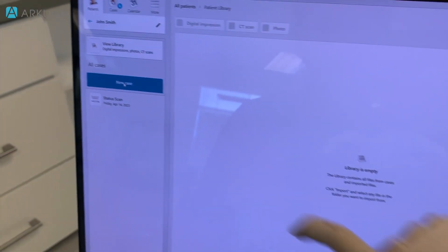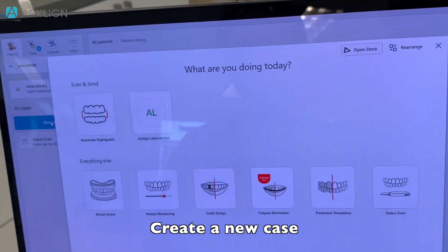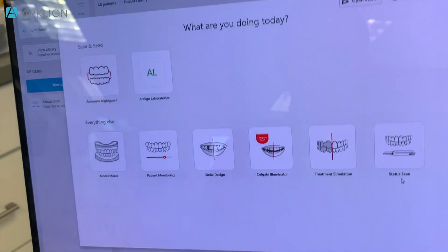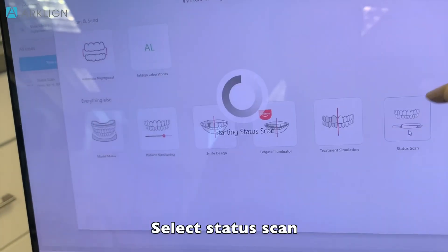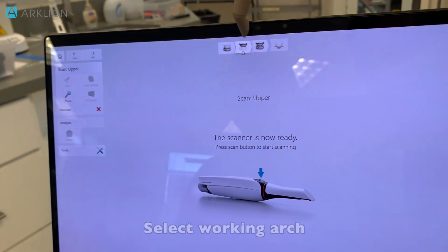So we're going to create an order to do the duplicate denture. You're going to click into your new case, and then you will select status scan. Because we're scanning the upper denture, so I'm going to select upper.